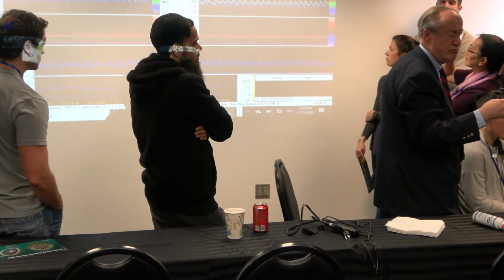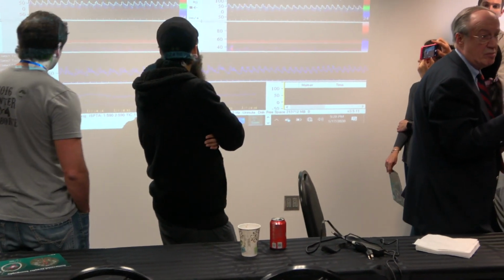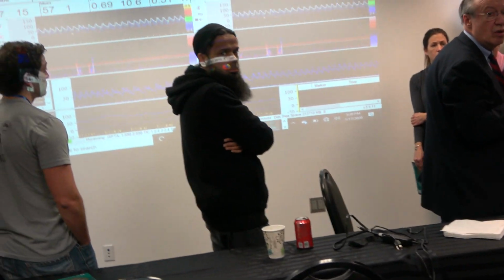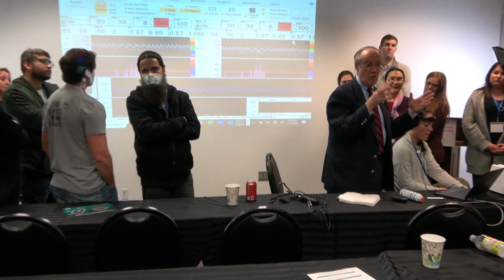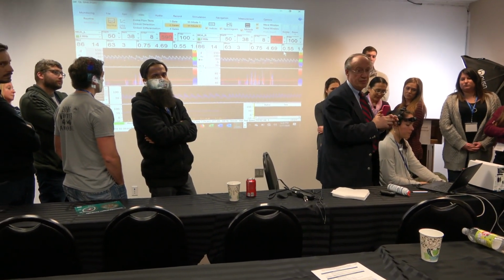Of course, all machines have certain markers. You can insert markers or do some other stuff. All right. I guess you change the depth varying which artery you're trying to find. Right, but again, during surgeries, we're mainly concentrating on middle cerebral artery, and it is depth 50, all right.